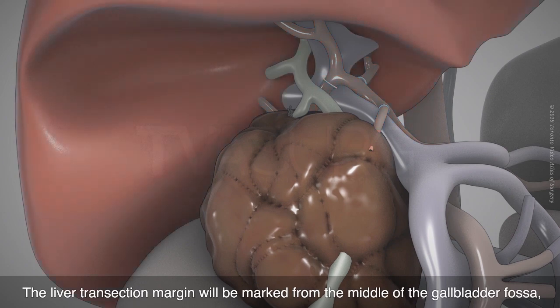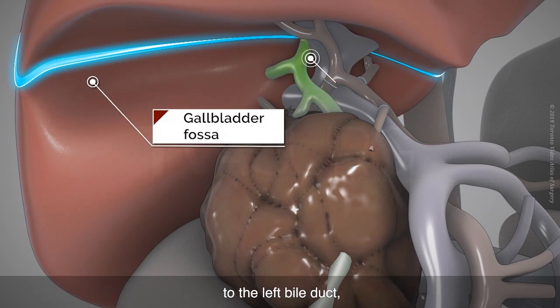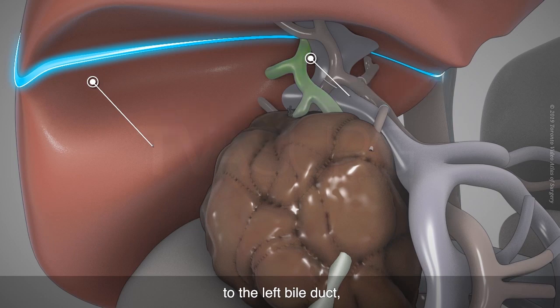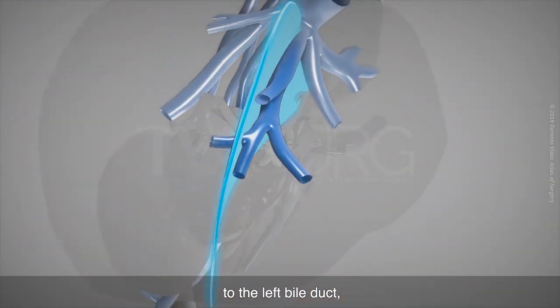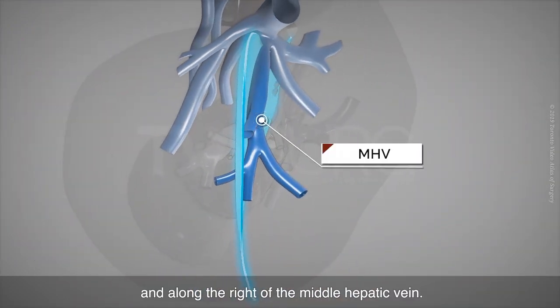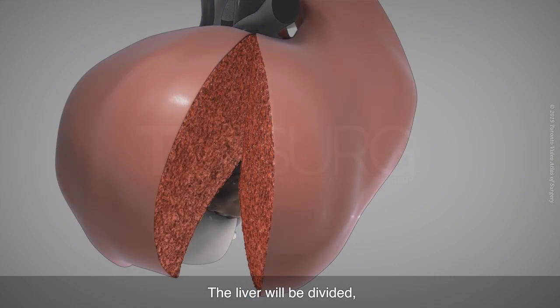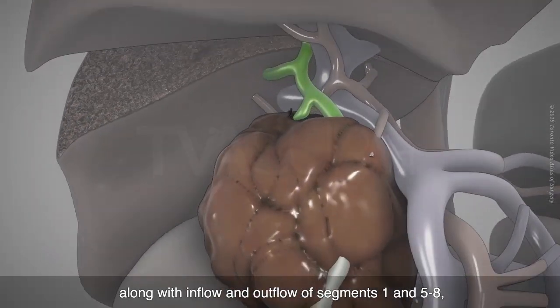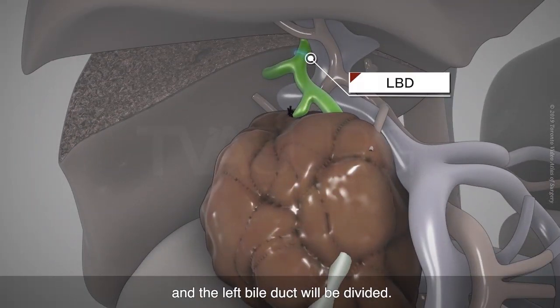The liver transection margin will be marked from the middle of the gallbladder fossa to the left bile duct, and along the right of the middle hepatic vein. The liver will be divided along with inflow and outflow of segments 1 and 5 through 8, and the left bile duct will be divided.